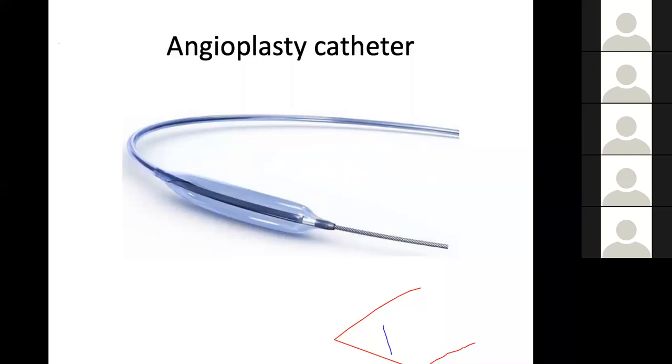But as long as you can say that these are balloon catheters, and the ones which are as thick as the diagnostic catheters are used for angioplasty, that is good. Microcatheters with balloons, usually they are used for balloon assisted coiling. And if you answer this much, that is really good enough.